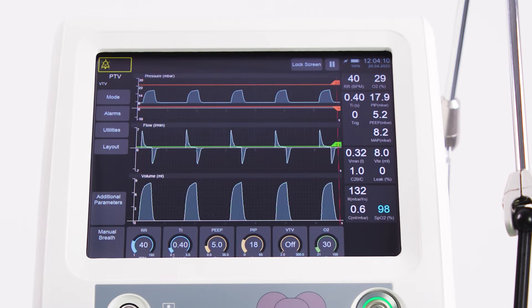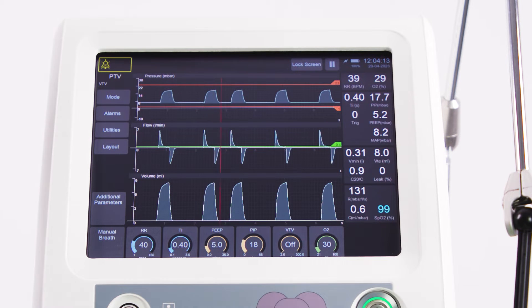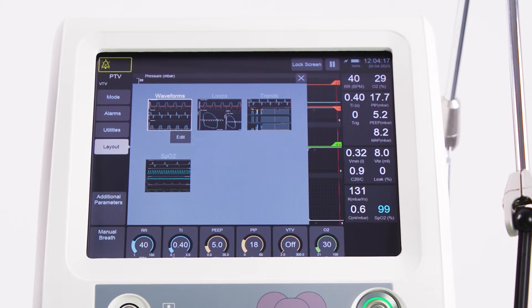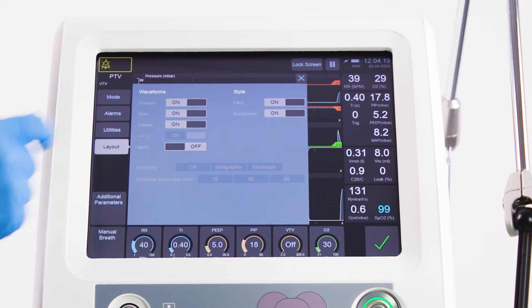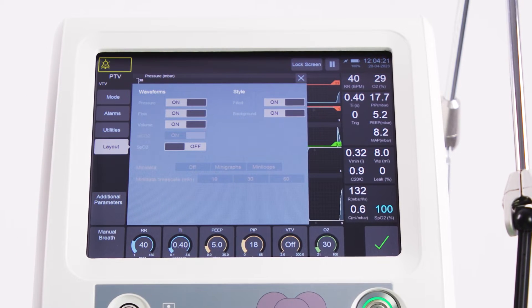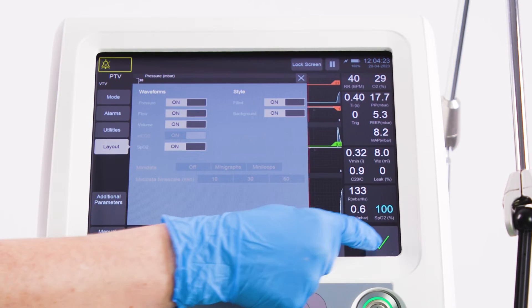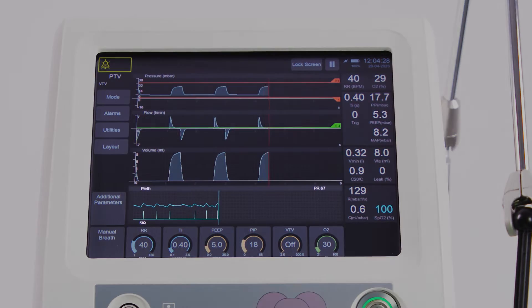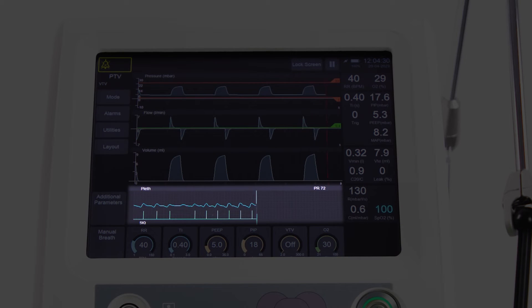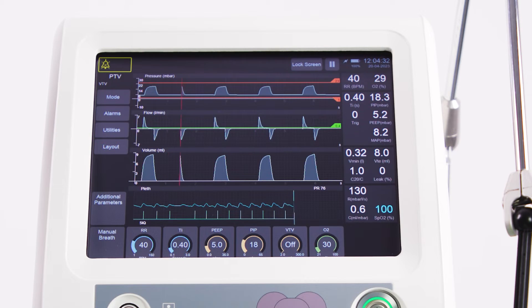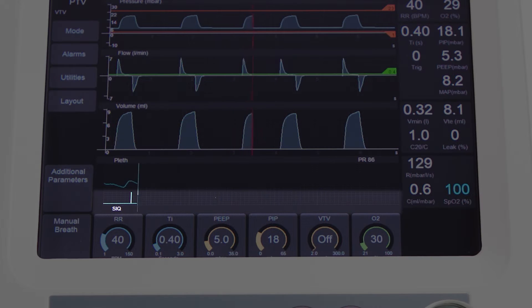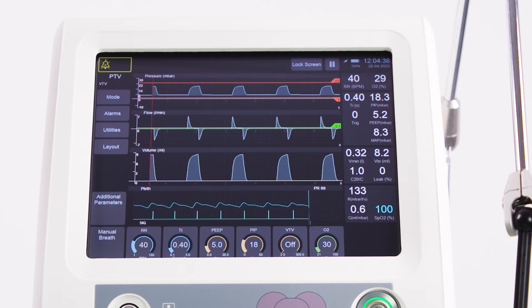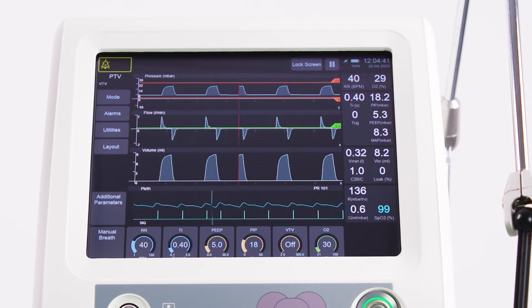At this point, the SpO2 waveform display can be turned on by going to the Layout button, selecting Waveform, then Edit, and then turning on the SpO2 waveform. Confirm this and close the Layout panel. The user will now see a plethysmograph waveform on the screen, plus SIQ or signal indicator quality and pulse rate values displayed.